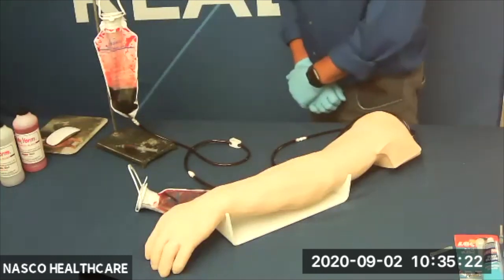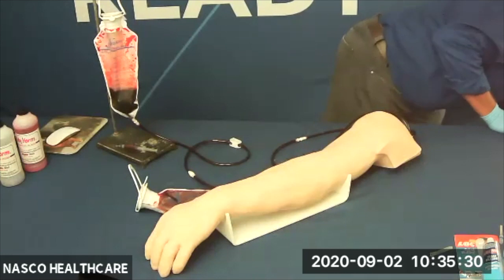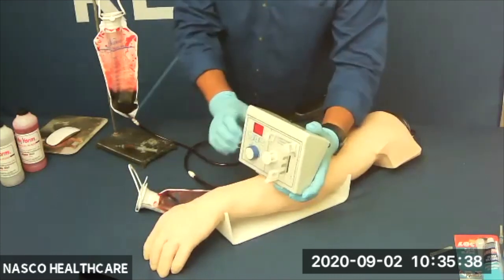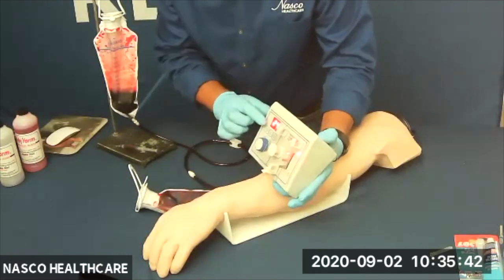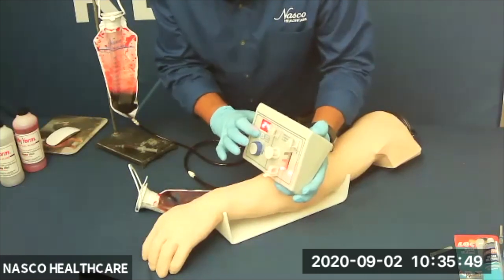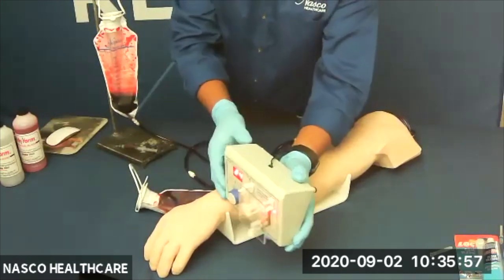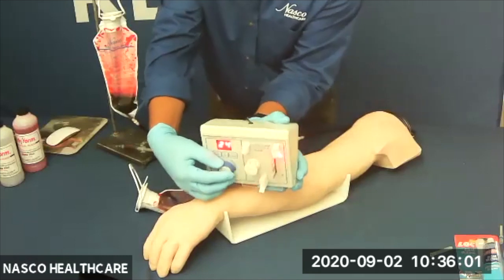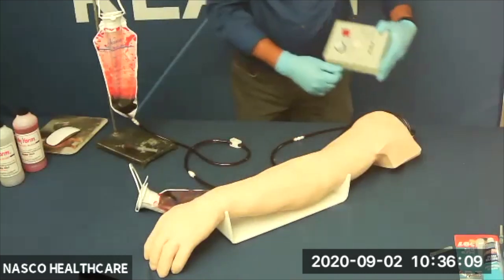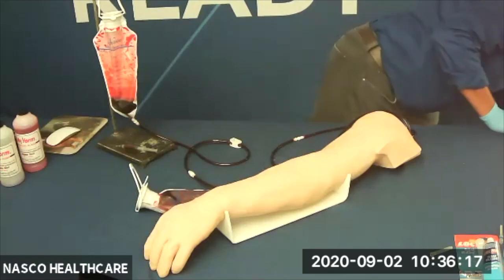This new multi-venous IV and injection arm also has the option to add an automatic circulation pump. The great thing about the circulation pump is it allows for continuous flow between the IV fluid bags. You can turn it on or off, adjust the speed, and go faster or slower as needed. This pump is offered in universal voltage, so it works in every country. Wonderful — universal voltage will work anywhere.